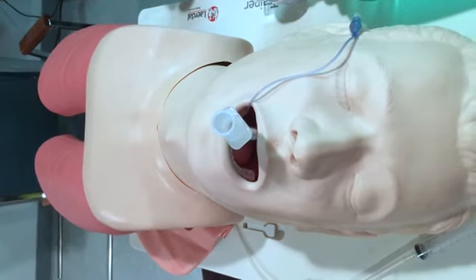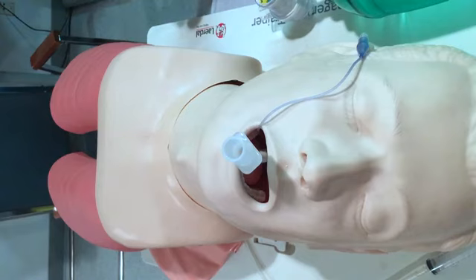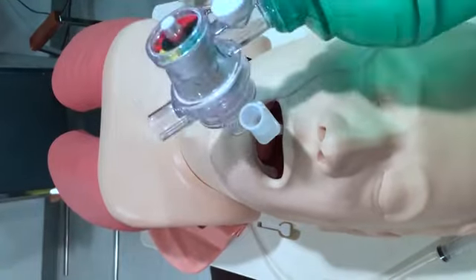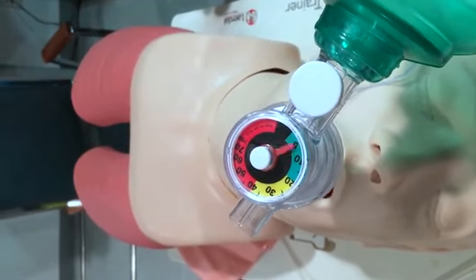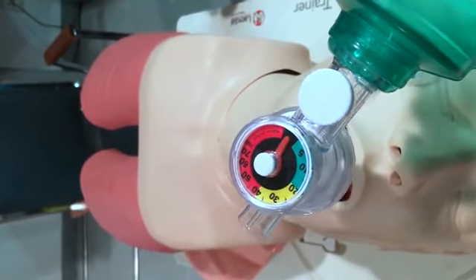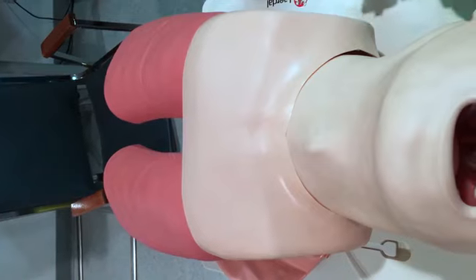So let's say you intubated the patient, you got overzealous, and you put the ET tube pretty deep. There are ways to identify endobronchial intubation, which is basically what this would be. This usually happens if you put the ET tube too deep. So let's say when you inflate and check, you have unequal breath sounds. The right lung is inflated and the left one is not. Sorry about the chicken noise. It's easier with our anatomy to do a right main stem intubation just because it's more straight than the left lung intubation.